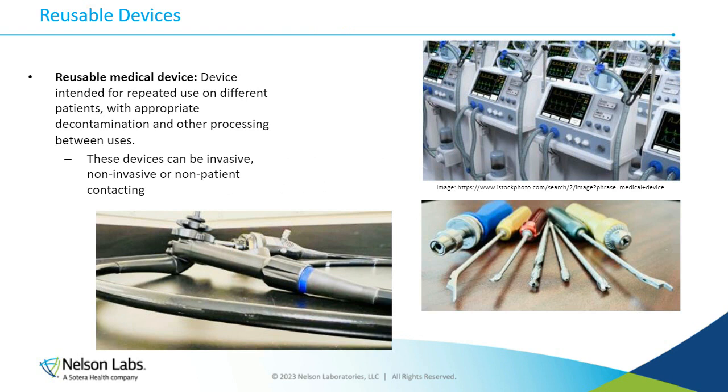First, I'm going to go over reusable medical devices. These are devices that are used on patients over and over again, but between patient uses, they are cleaned, disinfected, and/or sterilized. To ensure patient safety, that is a requirement that needs to happen. So these are just devices that are reused in healthcare facilities, home care, dental, anywhere you go. If you see a reusable device, you're sure to know that there are some instructions for use for them.